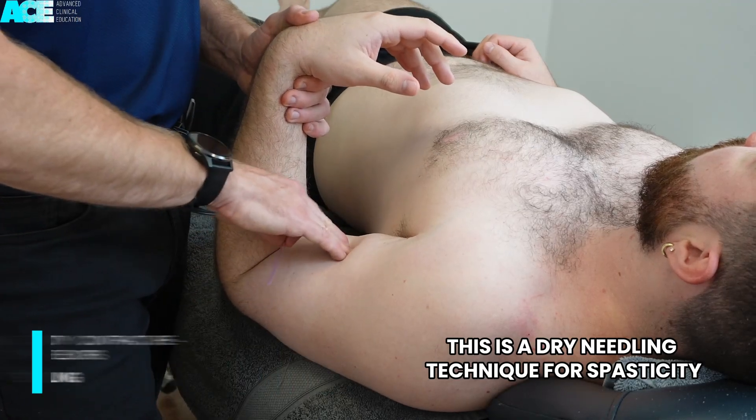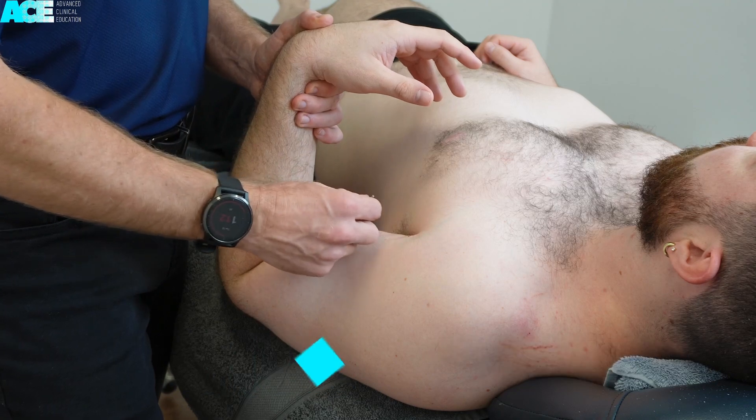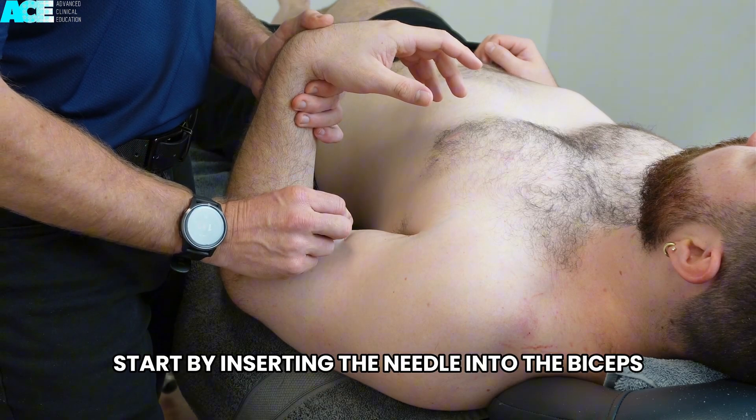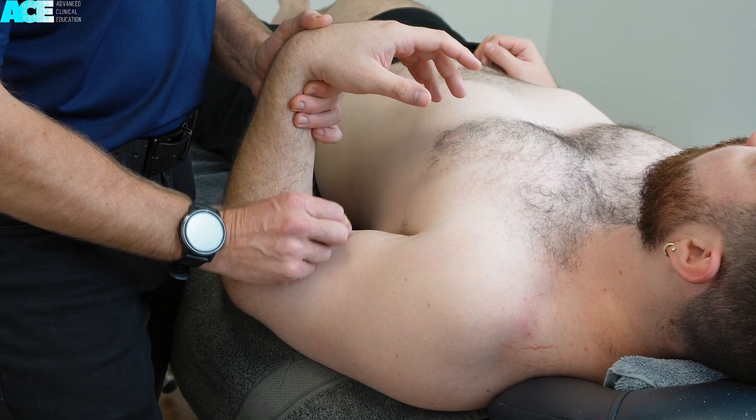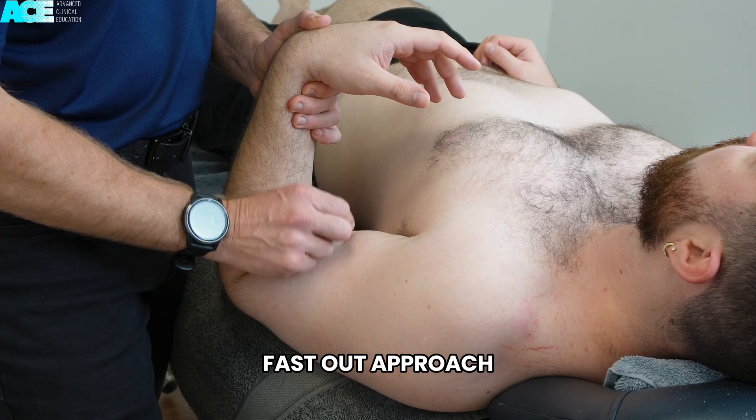This is a dry needling technique for spasticity or contracture of the elbow flexors. Start by inserting the needle into the biceps brachii muscle. Perform a pistoning technique, or a fast in, fast out approach.